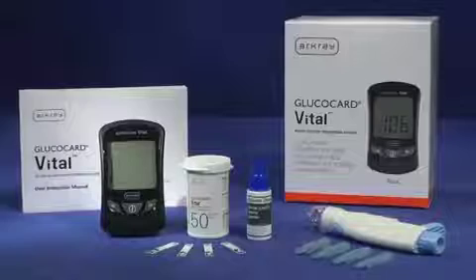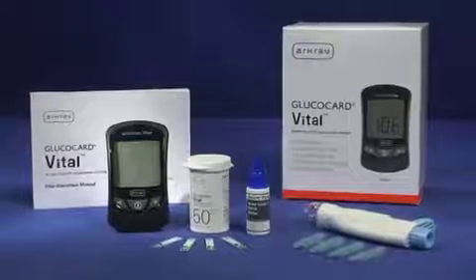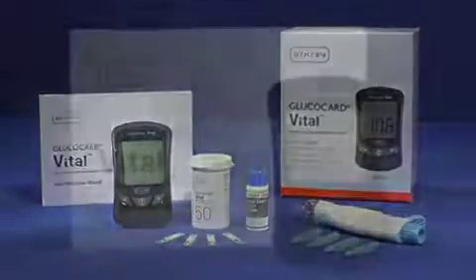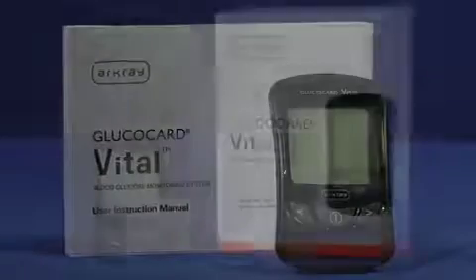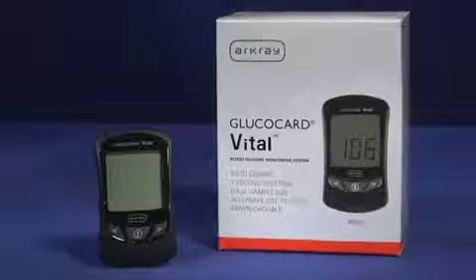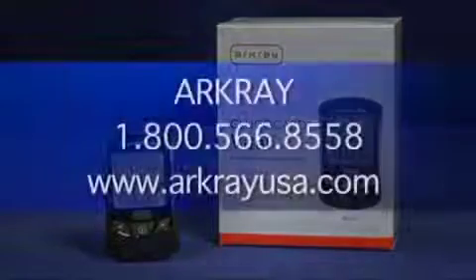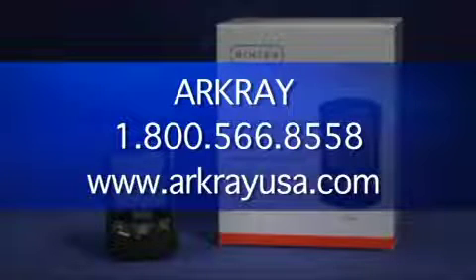The Glucocard Vital Blood Glucose Monitoring System is easy, accurate, and intuitive. To get the most out of the Glucocard Vital System, please review all of the information in the user instruction manual. Thank you for choosing the Glucocard Vital Blood Glucose Monitoring System. For additional information or questions on how to use this system, please contact ArcRay Customer Service 24 hours a day, 7 days a week at 1-800-566-8558.